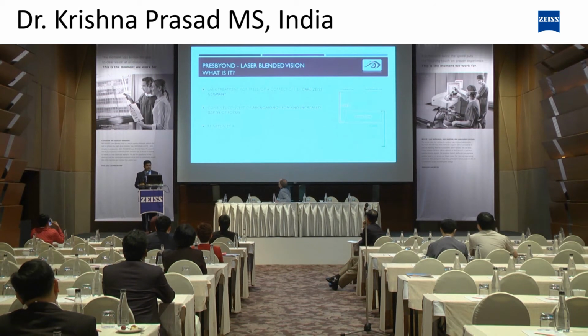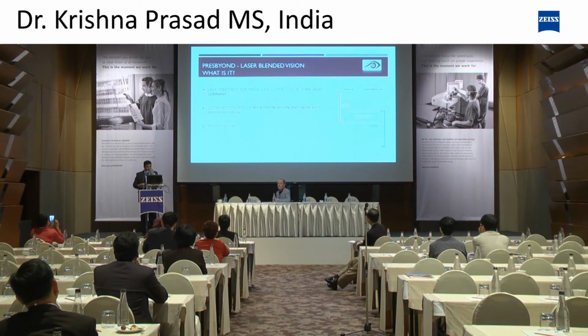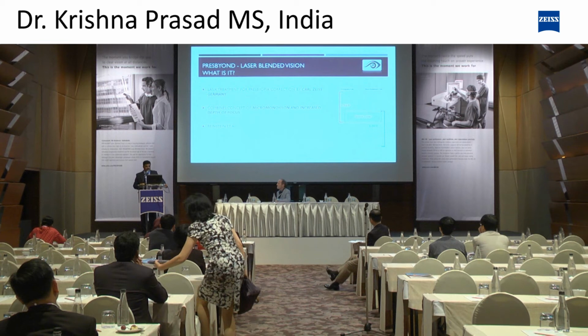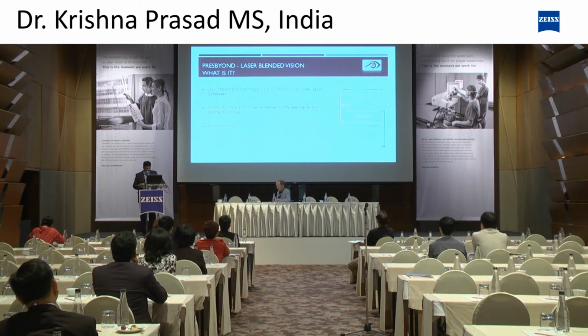I think you might have heard Dr. Sri Ganesh talking in the morning about what exactly we do in this treatment. Just for those who did not attend that session, this treatment is for presbyopia correction, exclusively by Zeiss. It's a combination of micromonovision and increased depth of focus. Of course, Dan Reinstein is the person who invented this technique.